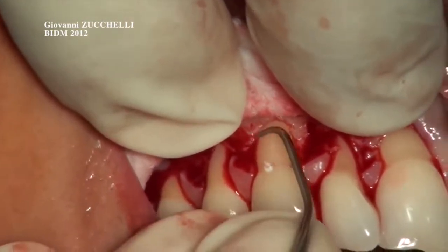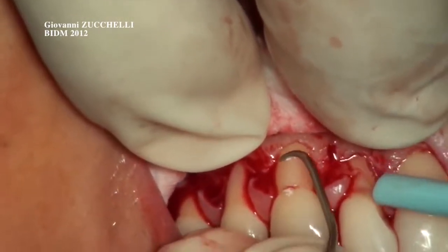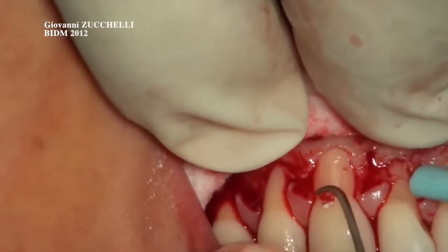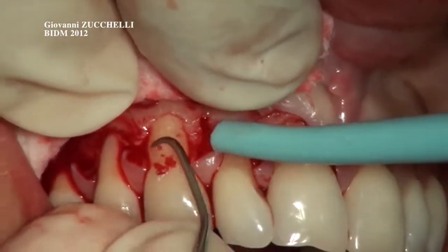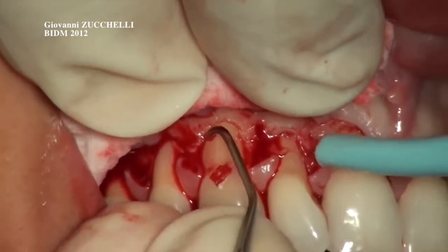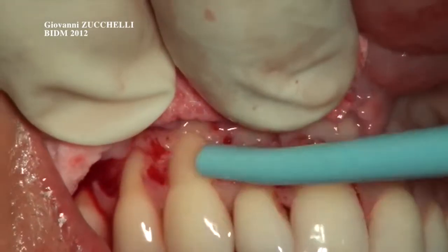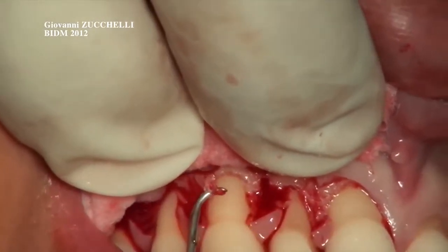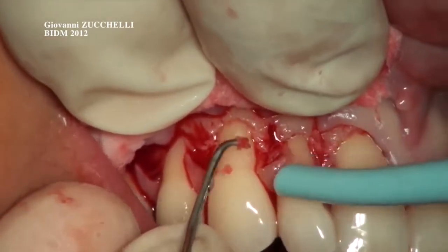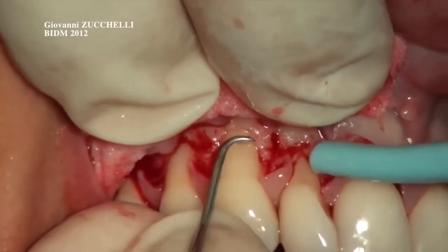If there are areas of bone lesions in the most apical aspect of the root exposure, which were not probable before the surgery and which were not exposed before the surgery, they must not be planed. In this area, there is cementum with still inserted connective tissue fibers that must be respected in the most apical aspect of the bone area. This will also reduce bone resorption during the healing phase.